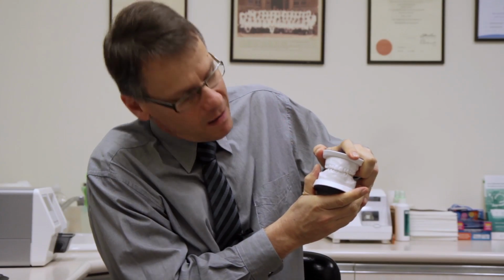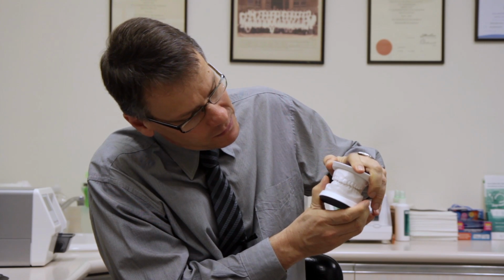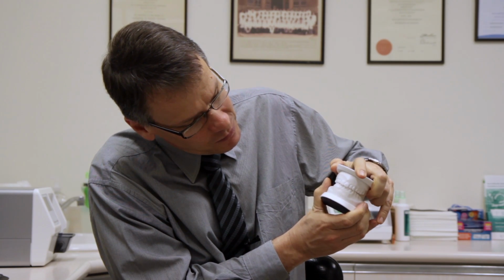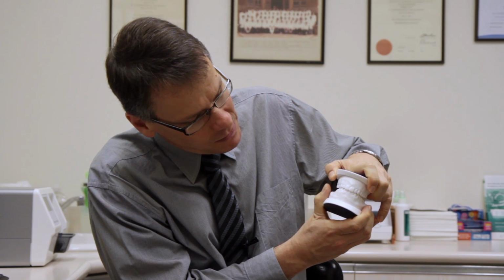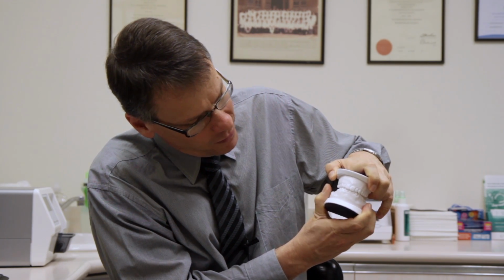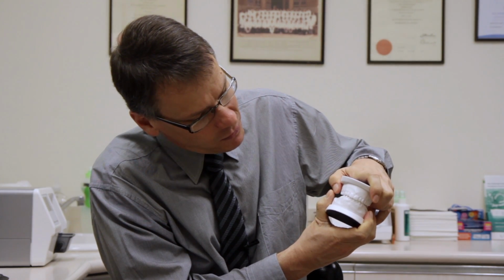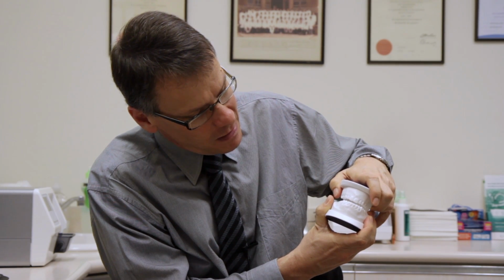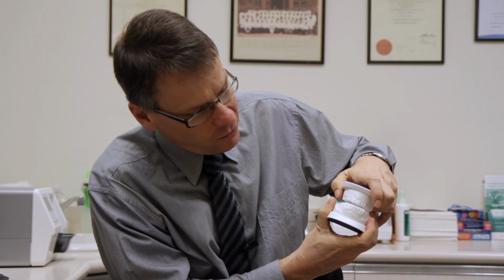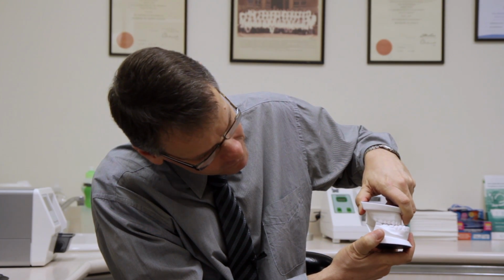Just to give you an idea how the oral appliance works, for example, these are models of somebody, and the general position of the teeth is the upper teeth just overlap the bottom teeth. Now what happens is the airway at the back of the throat gets blocked. With the oral appliance, which I will demonstrate to you in a minute, what we do is we move the bottom jaw forward like that, and then when the bottom jaw moves forward, it drags the tongue with it into the forward position, and in that way opens the airway at the back of the throat.